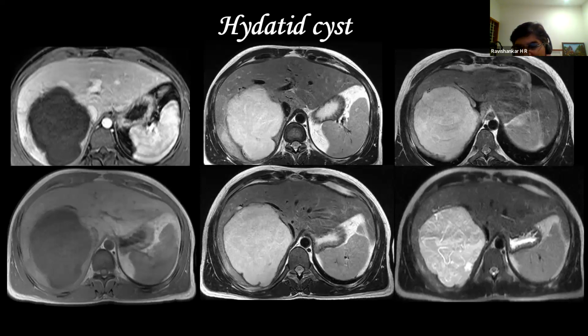That is why the radiologist is extremely important in picking up lesions, not just ordinary lesions which stare at you, which anyone can pick up. For example, many people would have missed the tumor in the background of a cirrhotic liver. If you hadn't done the fifth sequence, you would have definitely missed it. So it is important to know what investigations and what sequences to do in what situations, and to give the clinical information to the radiologist so that they can go after whatever you are looking for and give you the answers.